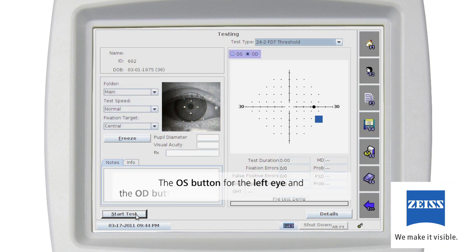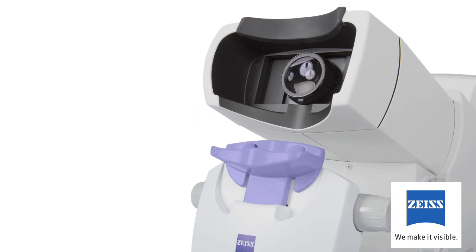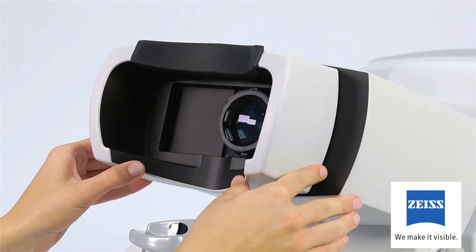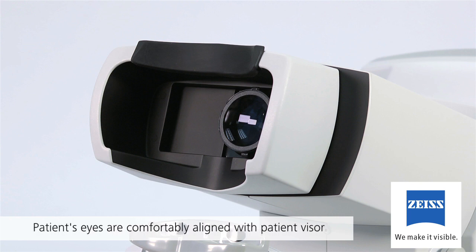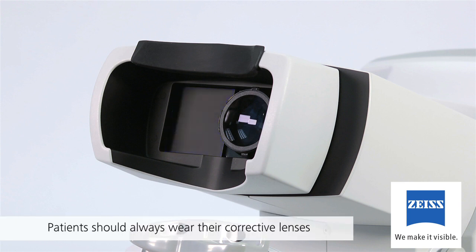Test speed provides the ability to slow down the test speed. Alternative fixation targets give you the option of using a large crosshair or four dots, depending on the test type, as a fixation point for patients with central fixation loss. The eye to be tested first can also be selected — clicking the OS button for the left eye, while OD for the right eye is the default setting. Patients should always wear their corrective lenses, particularly if their refractive error is greater than plus or minus two diopters for central field testing, three diopters for threshold testing, or six diopters for screening.